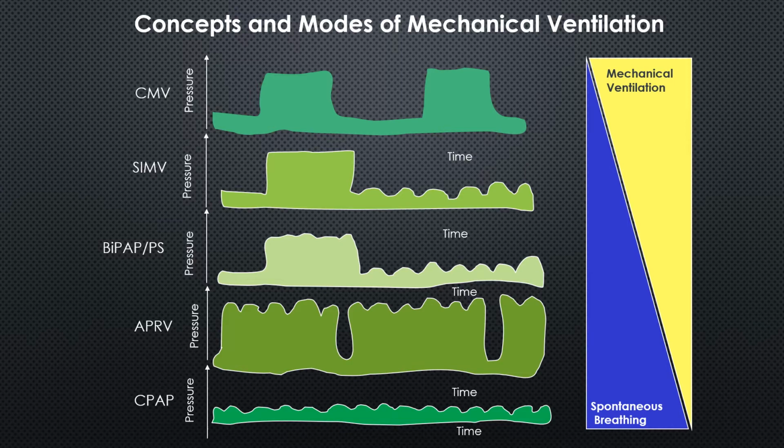The next mode is airway pressure release ventilation. In airway pressure release ventilation mode, in short known as APRV, a high level of CPAP, for example 20 to 30 centimeters of water, is maintained for a period of 5 to 6 seconds, with brief episodes when the airway pressure is allowed to fall in order to augment carbon dioxide clearance. It is important that spontaneous breathing is maintained throughout to ensure carbon dioxide control. Airway pressure release ventilation allows the application of a high mean airway pressure to improve lung recruitment and oxygenation.